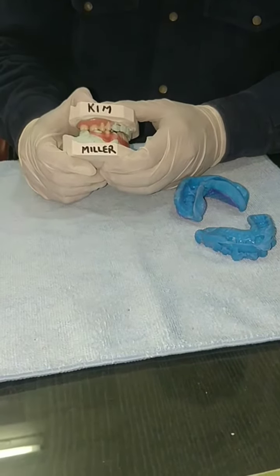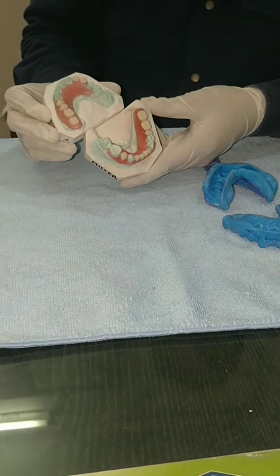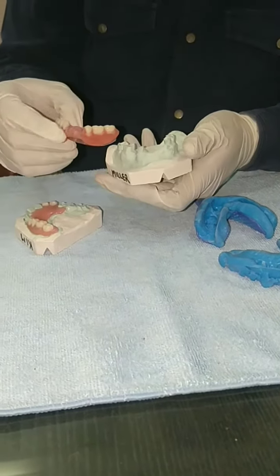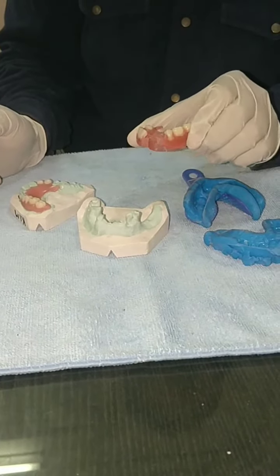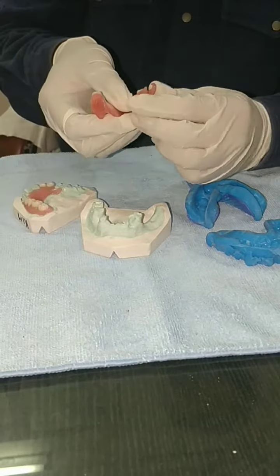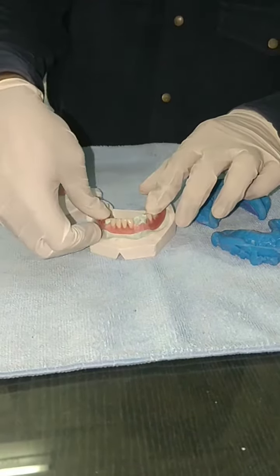Here again with a new flexible partial for patient Kim Miller. This is an upper acrylic partial and this is a lower flexible partial. Let me show you its flexibility — the model was joined here, we have cut this area and now you can see the flexibility. They can just wear it like this; initially it could be a little loose but they can tighten it by just pressing the clasp inward.